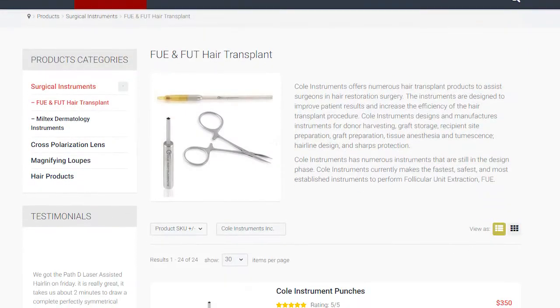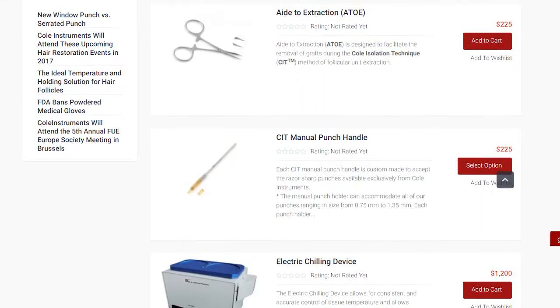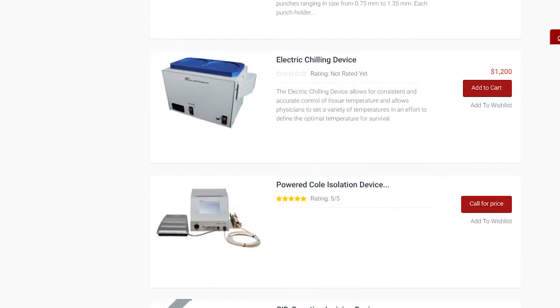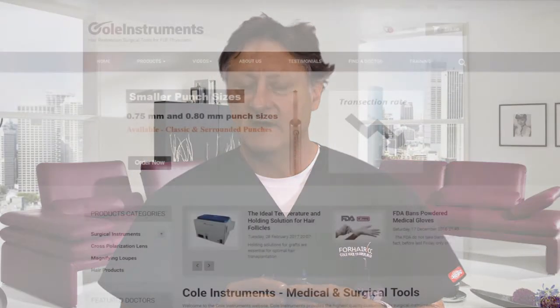I invite you to look into our instruments more closely. I hope you'll enjoy our new Vortex nose cone. It's lighter, precise, and doesn't require any lubrication. Thank you.